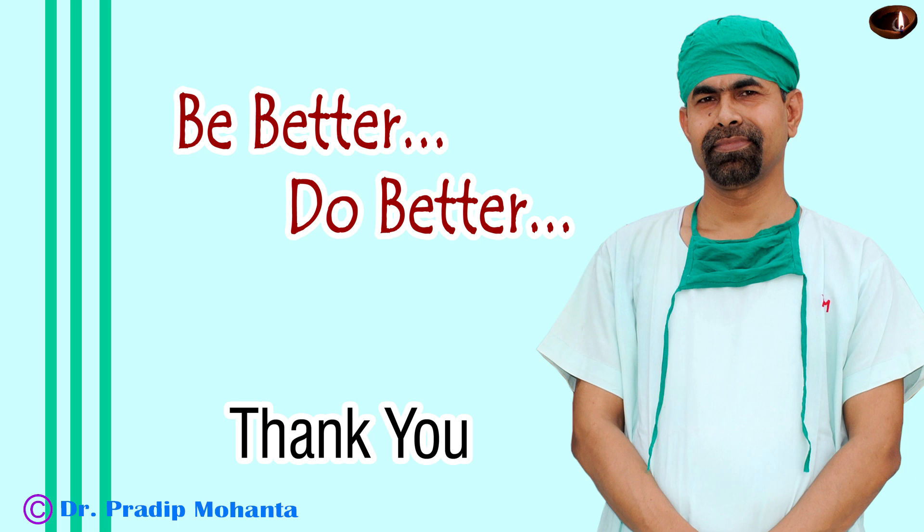Thank you very much for your attention. Hope this video will help you in developing your surgical skills. Divide and conquer technique is the basic technique which any new eye surgeon must master first, because you train your foot, you develop hand-eye-brain-foot coordination, and you come to know your phacoemulsification machine through this technique. So always learn this technique first and then go to direct chop technique.